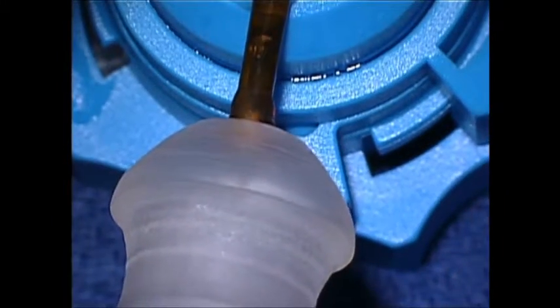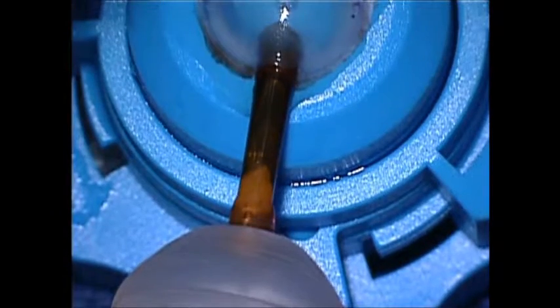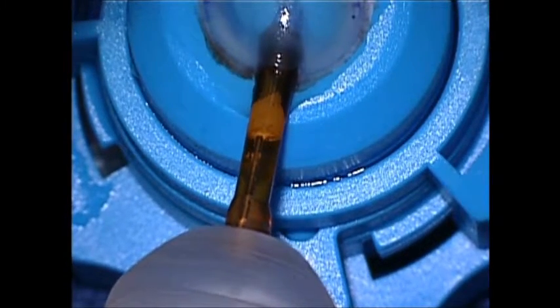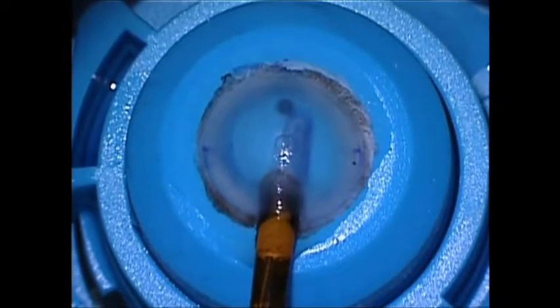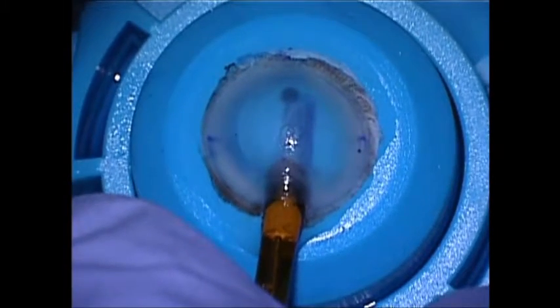The outer protective cylinder is slid to cover the graft, and the cylinder is rotated 180 degrees so that the overlapped edges are upward. The device is placed into the wound with the correct orientation of the tissue — again the overlap upward — and the inner cylinder is then inserted further into the eye.